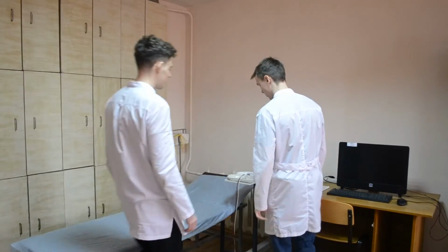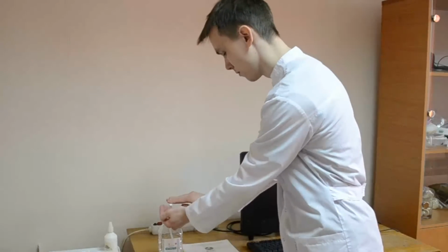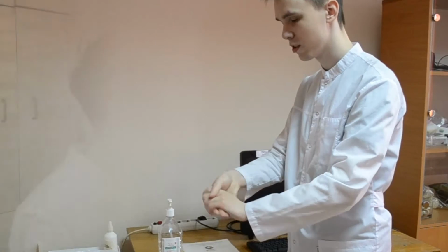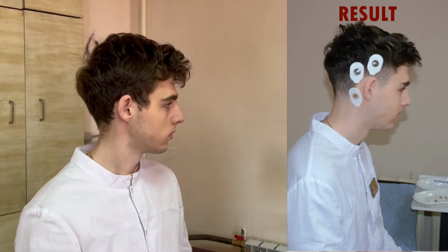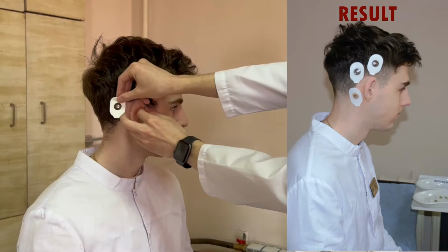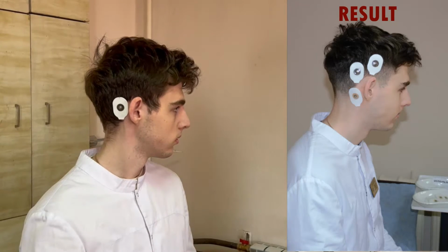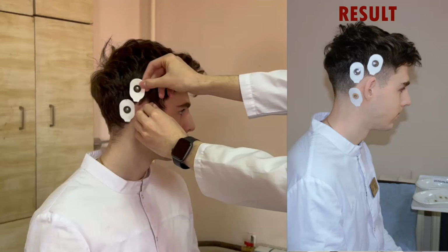Firstly, when you ask your patient to come in, you can ask him to sit down on the couch and clean your hands with the antiseptic. Then put the electrodes on the patient's head, as in the video. It's important that the electrodes are firmly attached to the skin, so a more accurate and right result will be obtained.